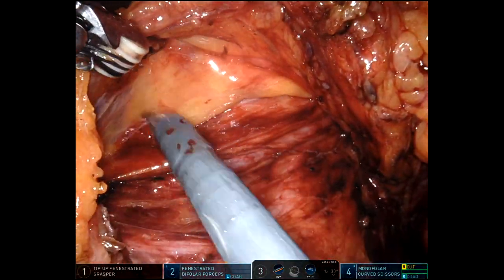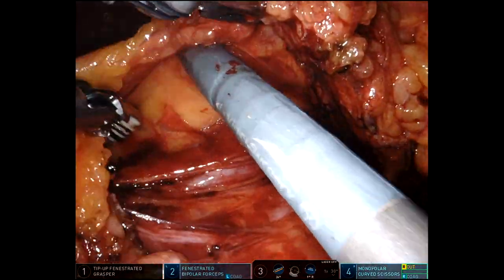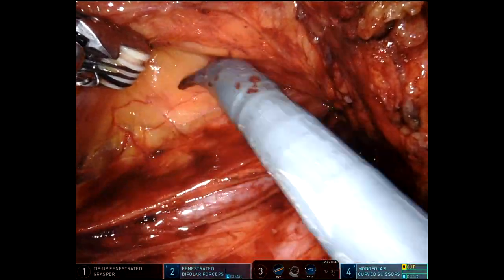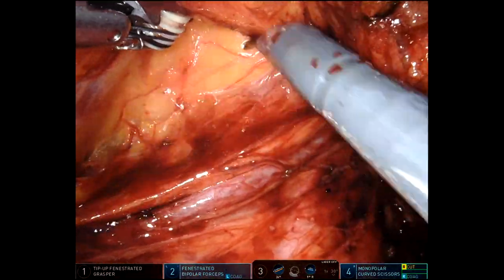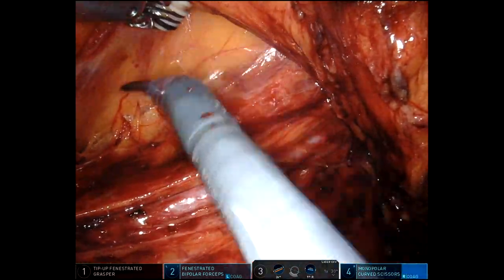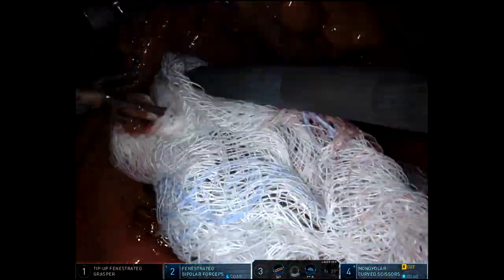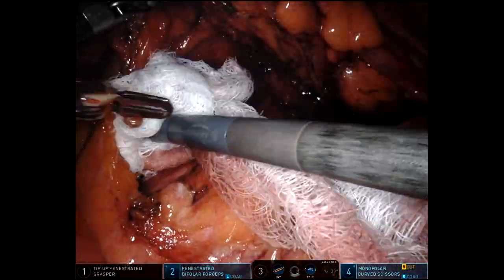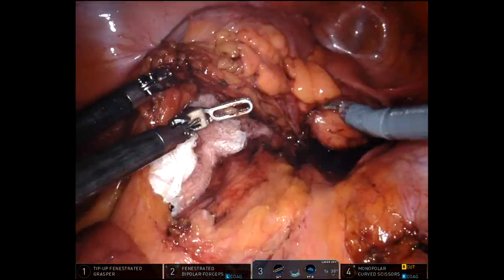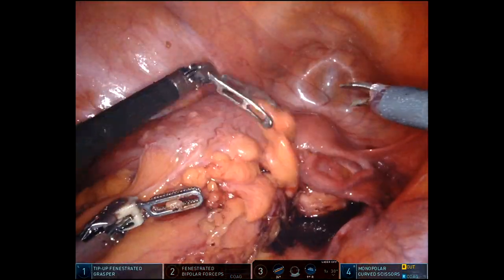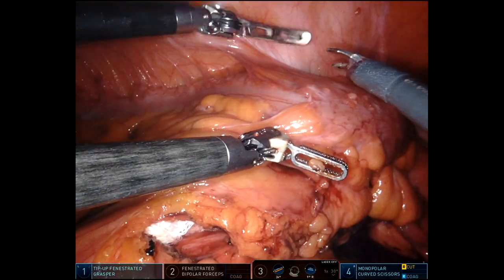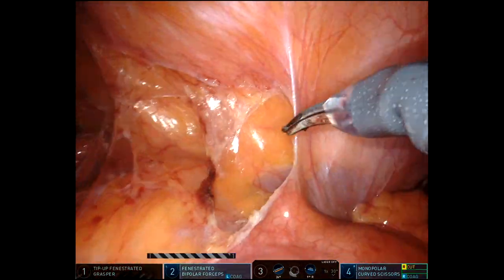As I said, usually the retroperitoneal plane is unviolated, as you can see here. Once I've adequately completed the medial dissection, I leave a sponge underneath there to keep the ureter posterior, and now I'm going to do some lateral dissection.